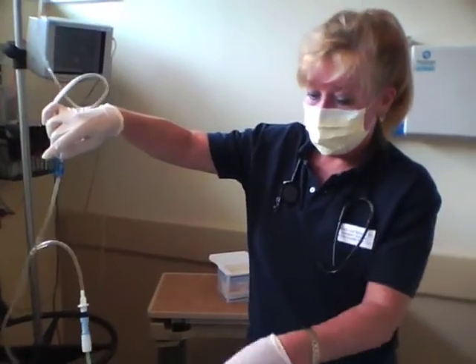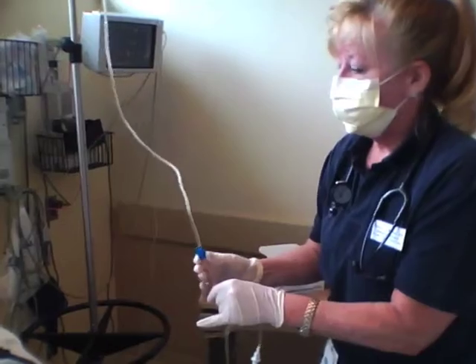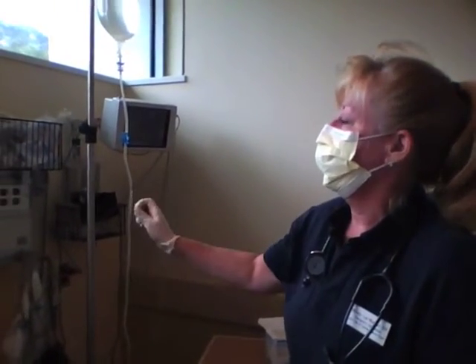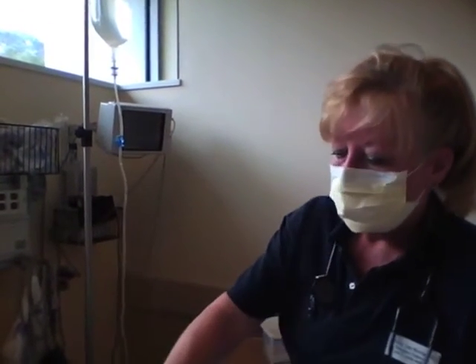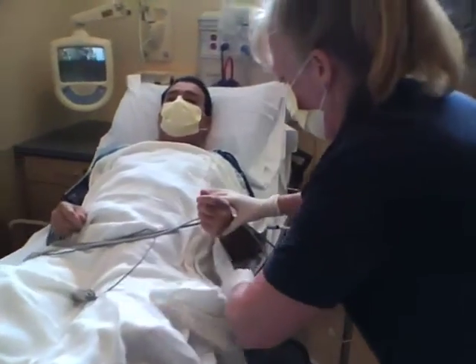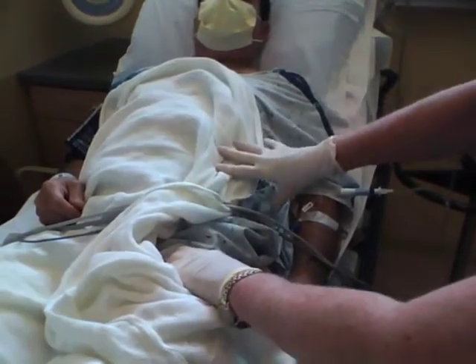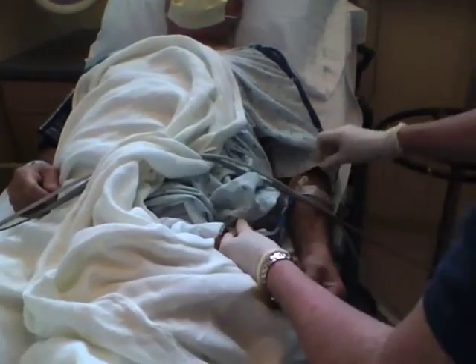It's just going to take the path of least resistance. It's not going to go to the patient even though you're open — it's going to go right into your drainage bag. So now we're going to open up our dianeal, and our hope is that this will infuse right in. You can see there's no roll clamp on here to control the rate of the infusion of dianeal into the peritoneal cavity — it can go quickly. The physician is going to determine the dwell time, and that's the amount of time that the dianeal is in the peritoneal space. And then we're going to drain him.